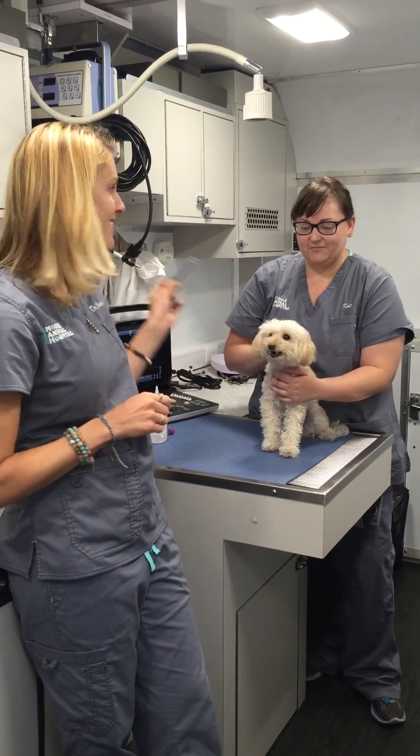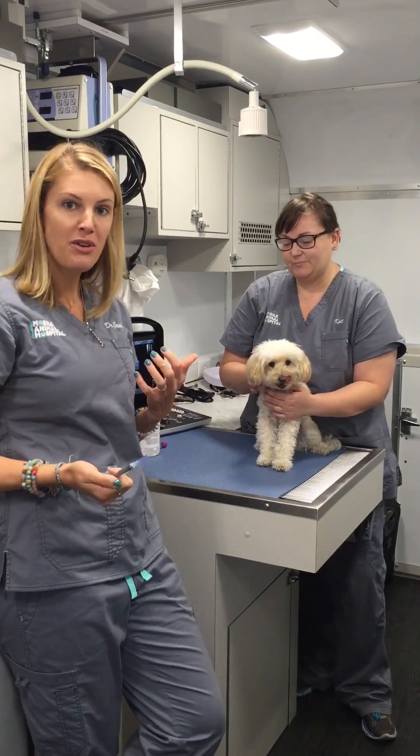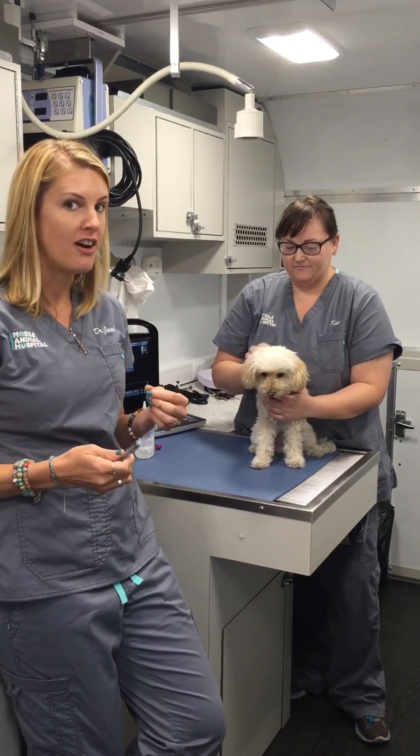Hi, I'm Dr. Jamie. This is Kat and this is Madame Mim. We're going to show you today how we do a blood draw in a dog.